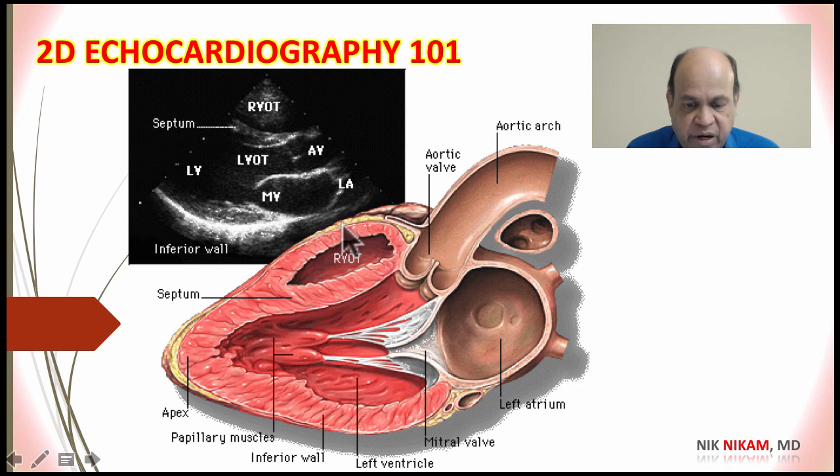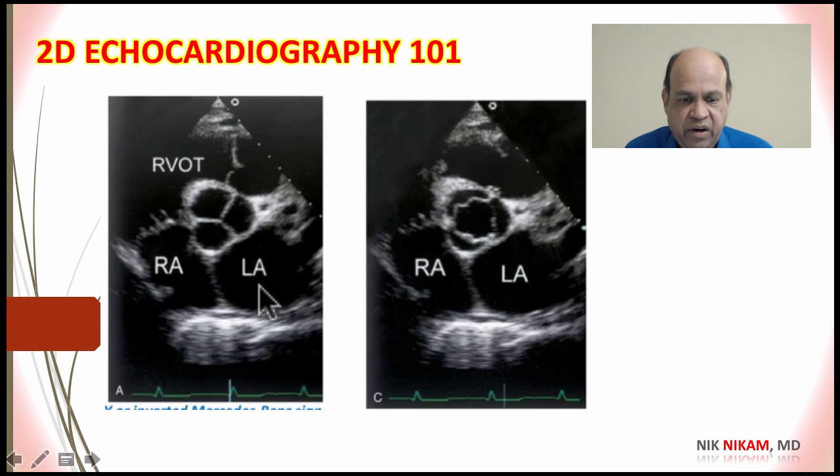And to translate that into an echocardiogram, here we have the interventricular septum, and this is the right ventricular cavity. Here we have the aorta with smoothly rounded aortic cusps, and behind that is the left atrium, and here we see the anterior and the posterior leaflets, and behind that we have the left ventricular posterior wall, and this is the pericardium. This is a cross section at the aortic valve level echocardiogram.